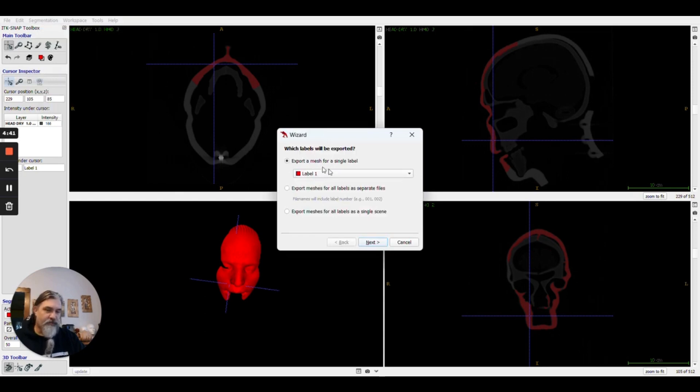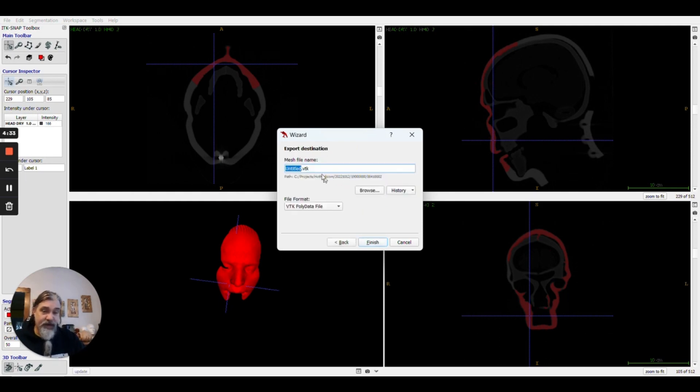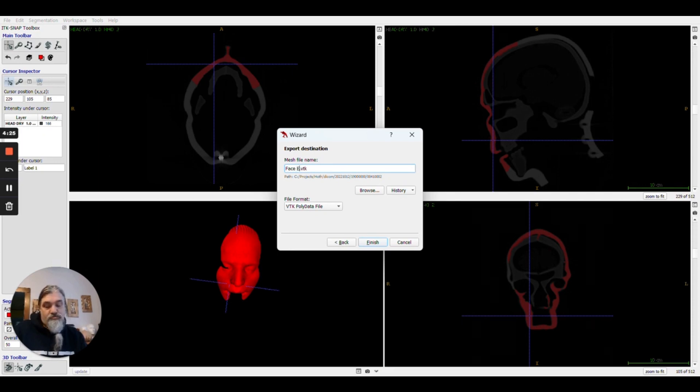For our purposes where we've only created one object, we're going to leave it as export for a single label. I'm going to go ahead and pick next. We'll give it a name.